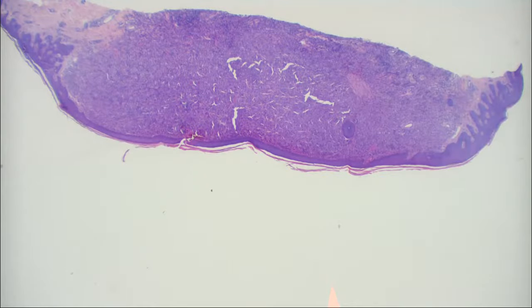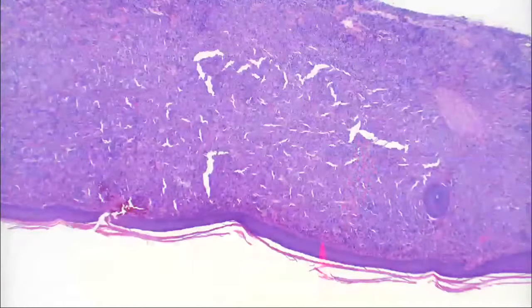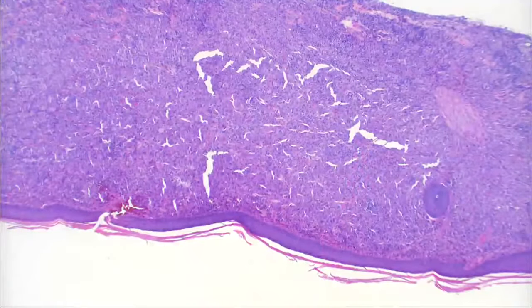It took me a little while to think about the cells. But I did notice on high power that there were some clefts. I wasn't sure if that was just from processing or not. Yeah, this stuff is just processed. When I looked closely at the cells, they were large, and almost had two different colors within the cytoplasm in places. They kind of had a halo around them. I would agree with that.